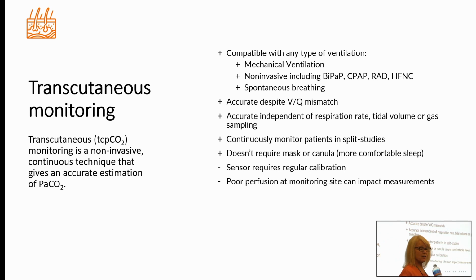Okay, we can move on to transcutaneous monitoring. Now, transcutaneous monitoring is going to be compatible with all types of ventilation, whether they're on non-invasive or high-flow types of support. And they're going to be accurate despite your VQ mismatches. It also measures independently of the patient's respiratory rate or tidal volume. It's just not relying on that exhaled gas for the sample. You can continuously monitor patients who are on split night studies without having to worry about your measuring device and if you're getting any air mixing with that.